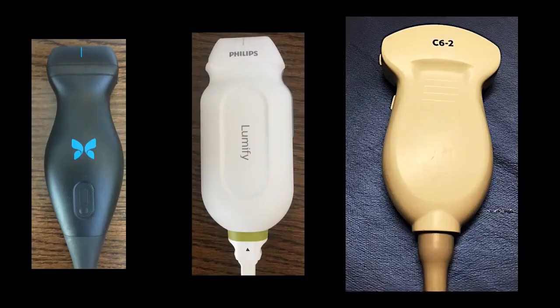We'll start off by talking about transabdominal ultrasound. So these are the probes that you'll use to assess for first trimester OB ultrasound. We have our Butterfly probe all the way on the left here, and our Philips Lumify probe here. And then we have our standard cart-based probes, our C6 probes. So all of these probes allow for lower frequency but higher penetration, able to see deep within the abdomen.